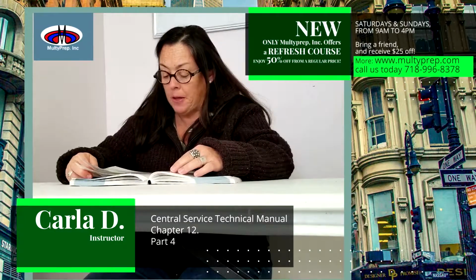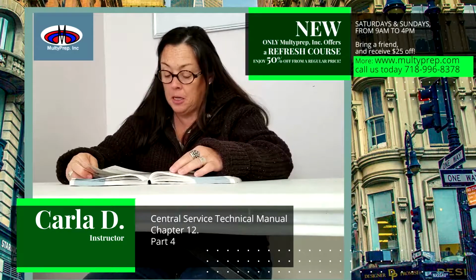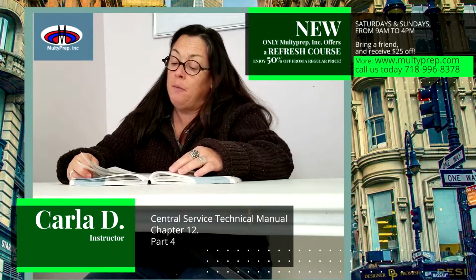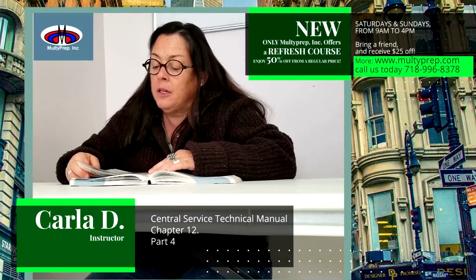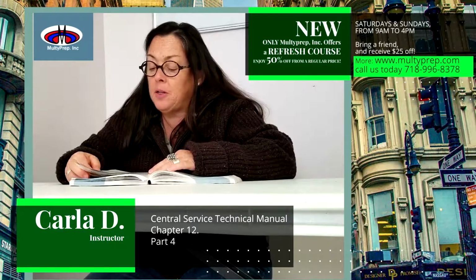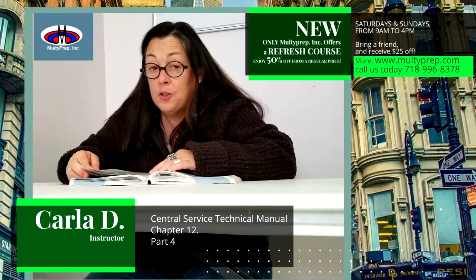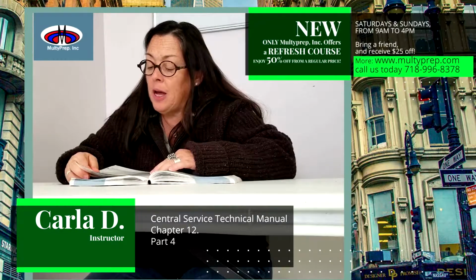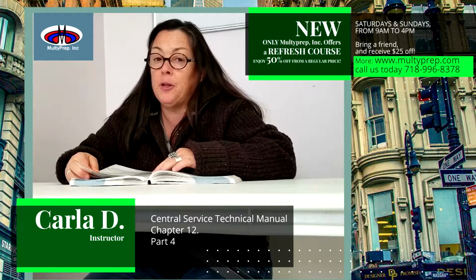When assembling linen packs, their size is limited to 12 inches in height by 12 inches in width by 20 inches in length, and they are not to weigh more than 12 pounds. Maximum density must not exceed 7.2 pounds per cubic foot, because higher densities may reduce sterile access to all contents. Linen wrappers should be securely applied without compressing packed contents. Contents must be packaged with sufficient spacing to enable the sterilant to reach all surfaces. Tight packing will not allow for fibrous swelling expansion. When expansion occurs, the sterilant will not penetrate the material.